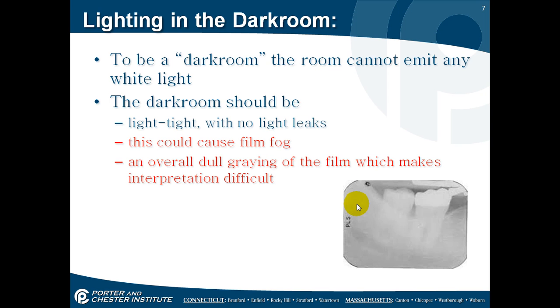You can see this X-ray here. You can read it kind of, but it's not clear. And so if you are starting to get a small caries, or you might have a crack in a tooth, it's harder for the dentist to interpret this film. It's not crystal clear, and that's because of a light leak.